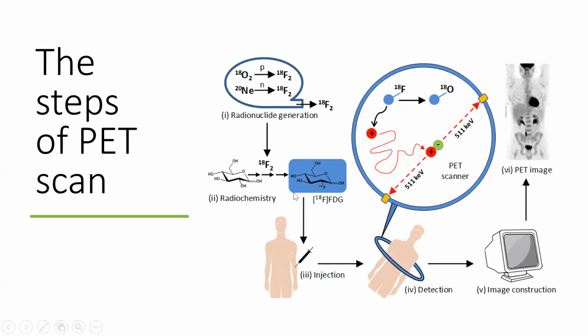The labeling is done in the chemistry module, of course, to have the radionuclide labeled with the desired radiopharmaceutical, such as FDG, sodium fluoride, gallium dotatoc, or dotatate. After labeling and dispensing the end product, it has to be dispensed via vial or syringe and then given to the technologist to be injected to the patient.